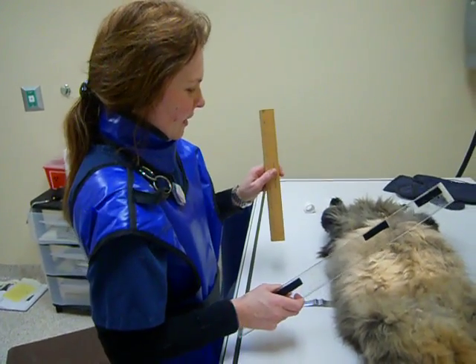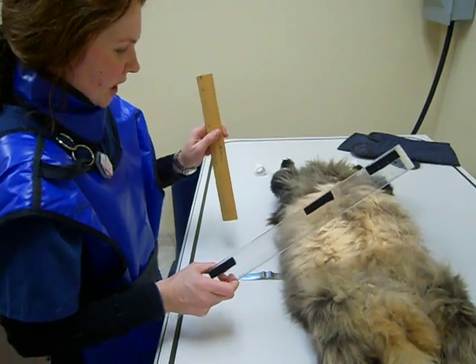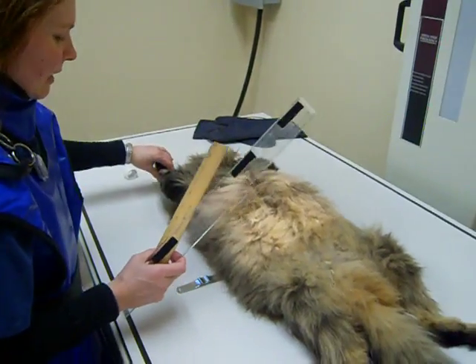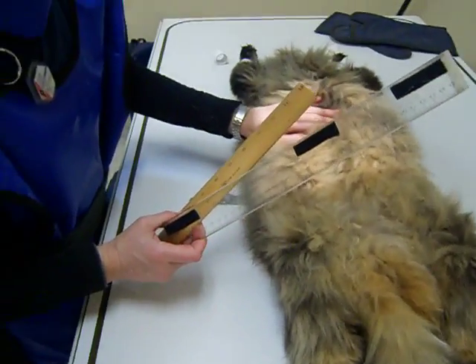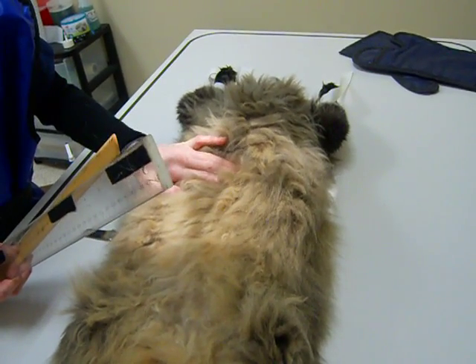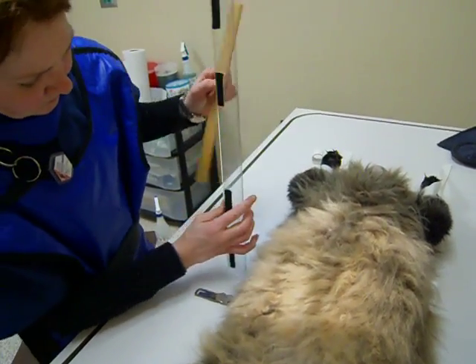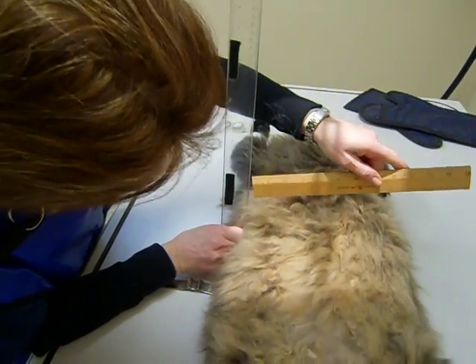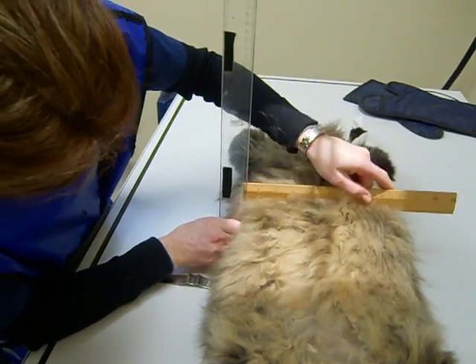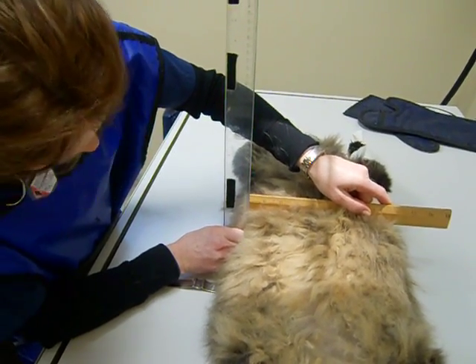As part of the GI study, we need to do a ventral dorsal projection of the abdomen. Again, we have to measure from 2 to 3 fingers width breadth from the 13th rib to get our exposure factors. This is 9cm.